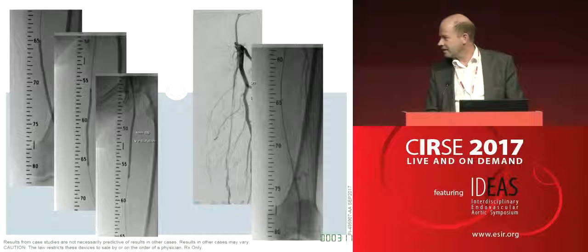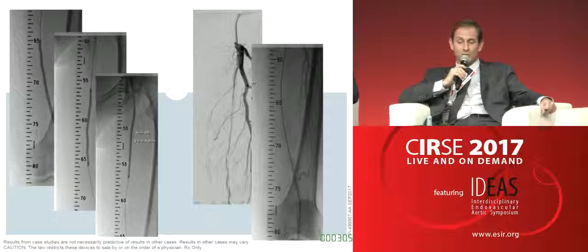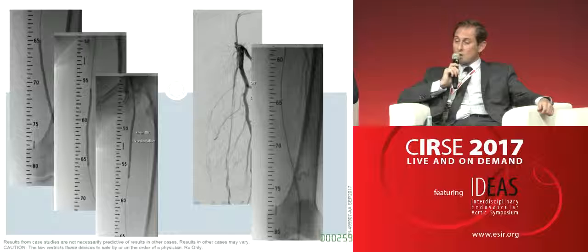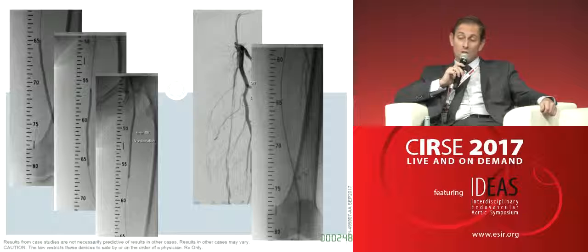Okay, I can go first again. I mean, looking at the pictures and from the very beginning, Gunnar, I think it's very difficult to resist not putting a stent in this case. The indication to begin with, claudication versus CLI, is a very good argument made by Jan, but in such a long, complex lesion, even in a claudicant, from the very beginning, I'm very, very keen to do a long drug-eluting stent, especially in the absence of a lot of calcification.